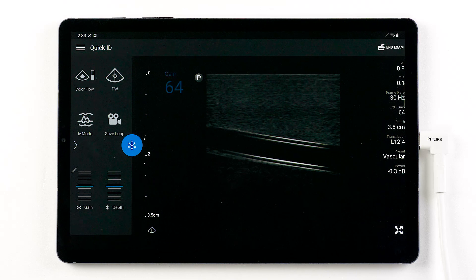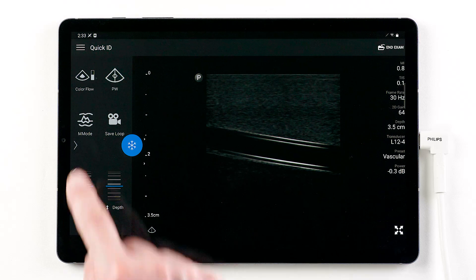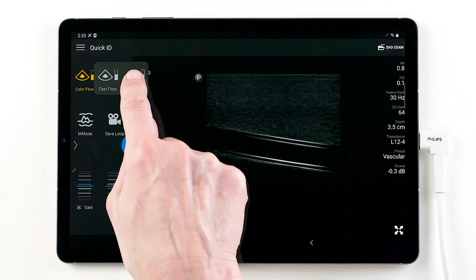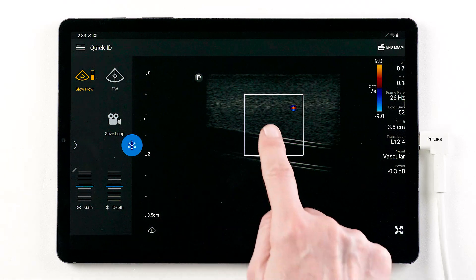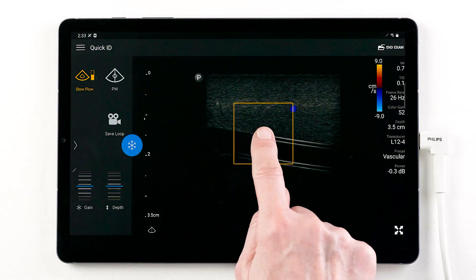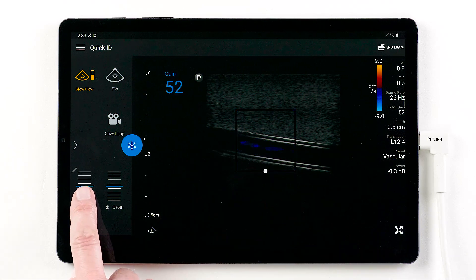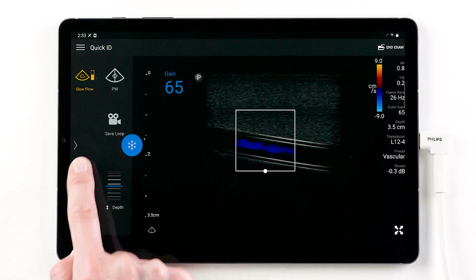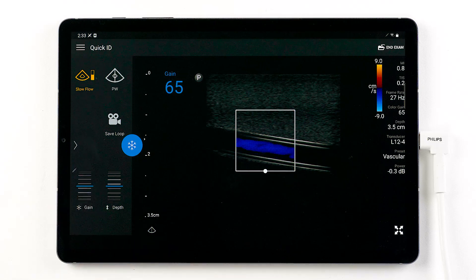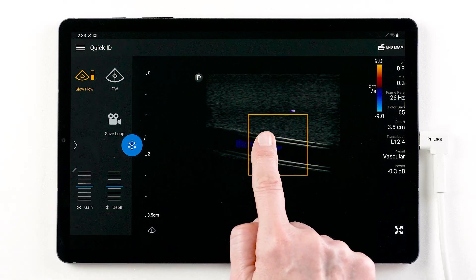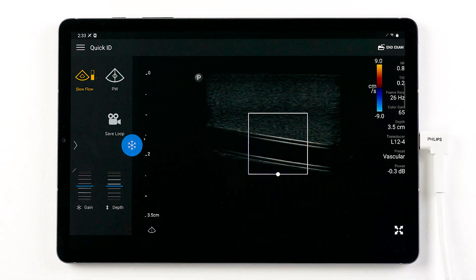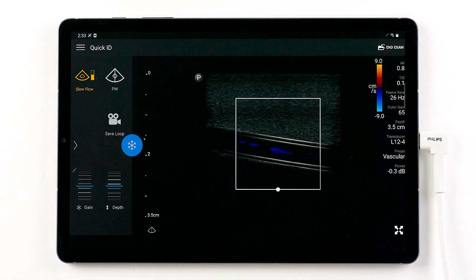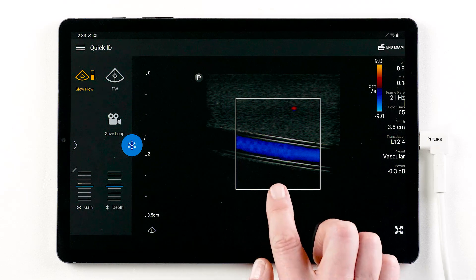Let's add color Doppler. A pop-out menu allows you to choose the desired color flow setting. Change gain control, drag the box position, pinch and expand to resize, and steer to the desired direction.